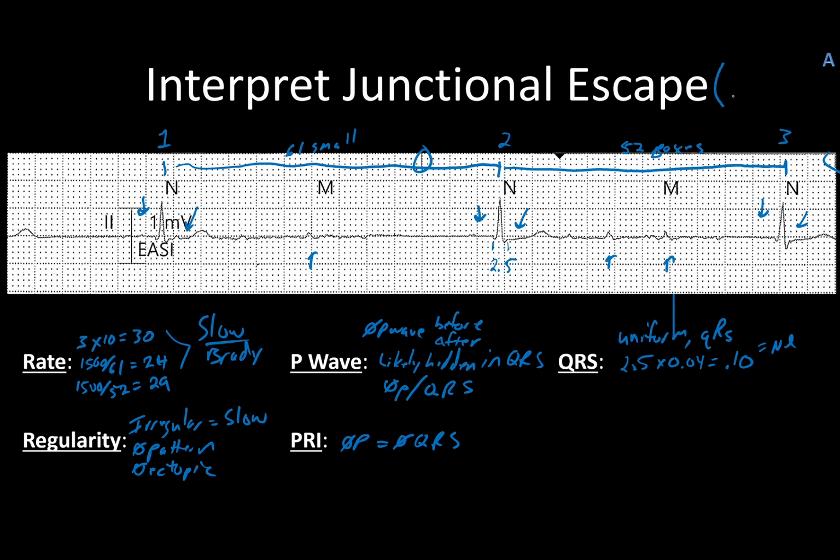That is the definition of junctional escape.